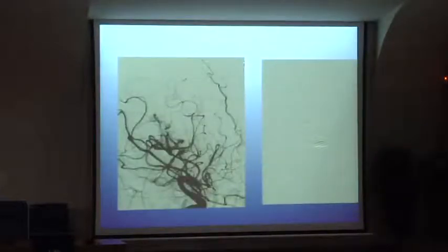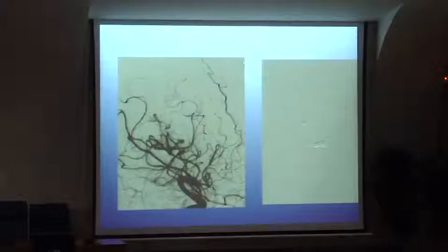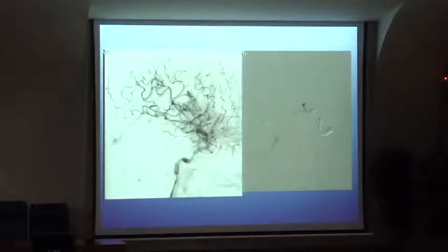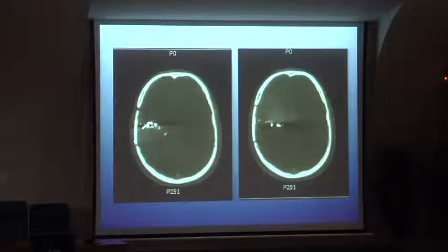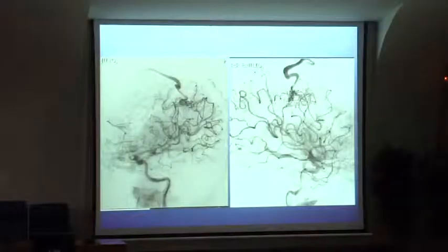Next. This is the control after embolization. I think it's okay. Next. But I have a small rest of the deep part in the internal cerebral vein. Next. Second catheterism. Next. A total occlusion by a venous approach. Next. This is the control angio, a CT scanner.